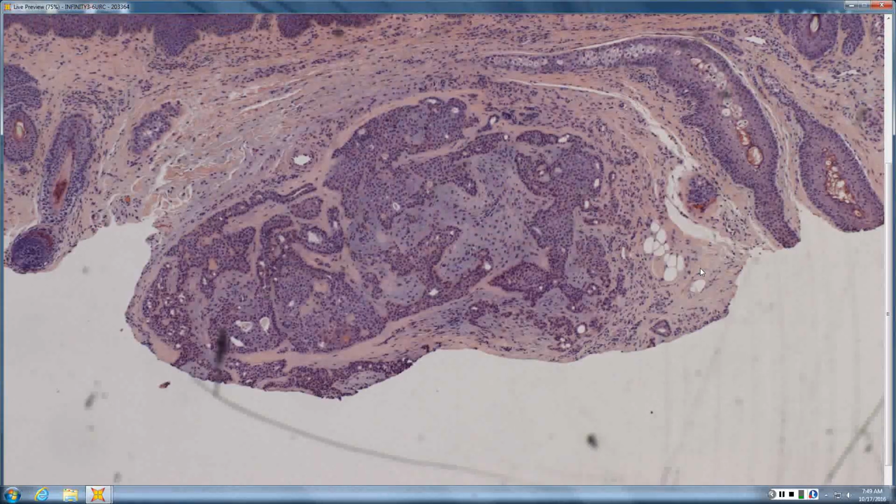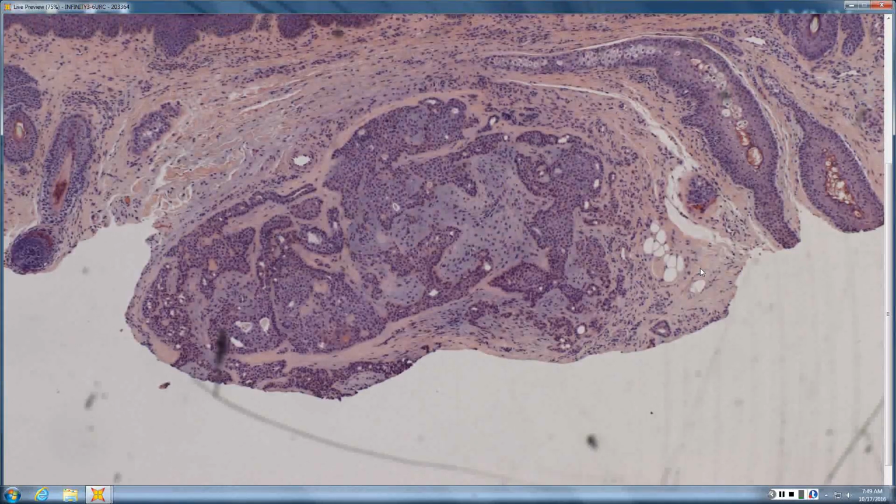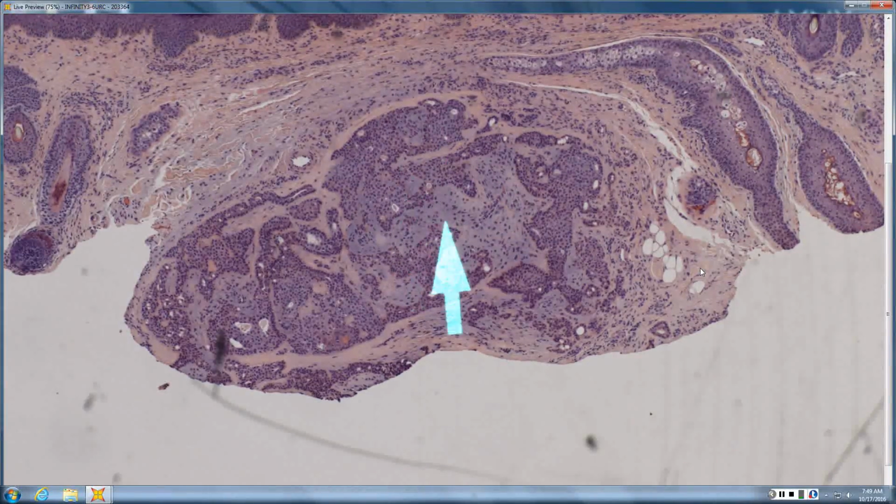So a dermal infiltrate looks like, is that mucin in it? There is definitely a steel gray myxoid stroma with branching alveolar glandular structures. Was it a mixed tumor? Like a mixed tumor, correct. So, mixed tumor, you can have small tubular type, or more commonly the branching alveolar type. So this is branching alveolar.